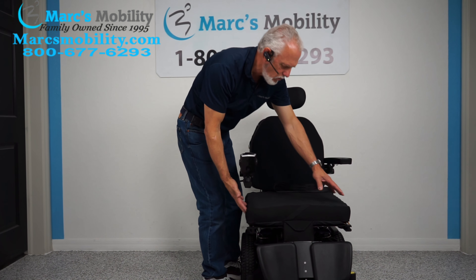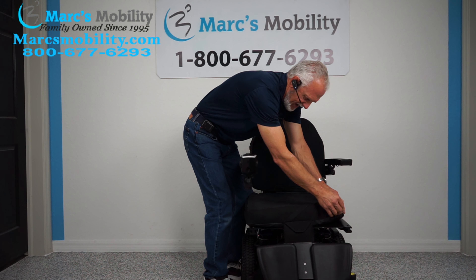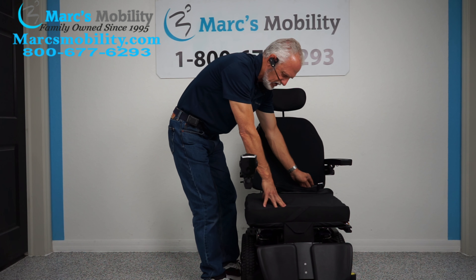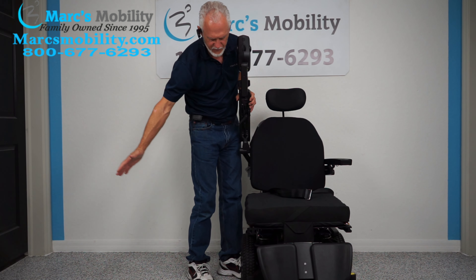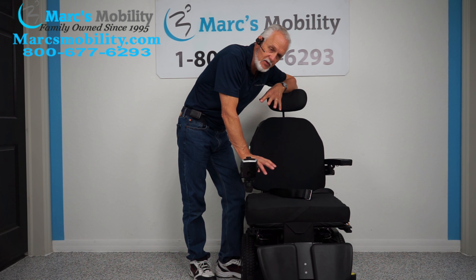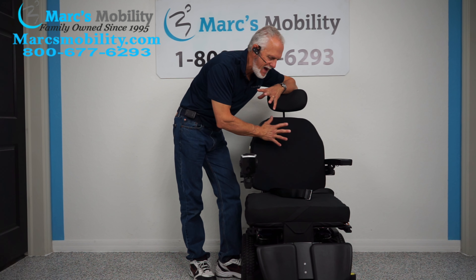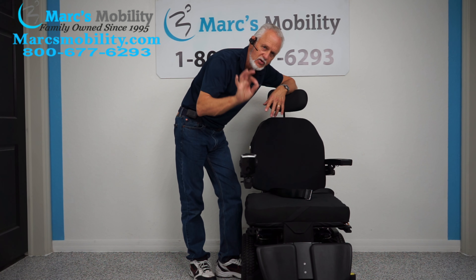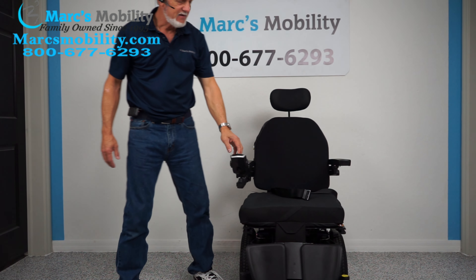Let's look at the chair now. The seat on this chair is 21 inches wide by 20 inches deep, so it's a large seat. This is a Roho cushion — one of the most expensive cushions you can get. It has a valve that you open up and pump air with a little plastic pump to adjust the pressure. It does have a safety belt. The arms flip up, so if you transfer from the side, both arms flip up. If this seat is too big for you, we can customize the seating system — we have all the cushions and backs, and we can make them larger, smaller, extend the legs, whatever size you need to fit your needs.